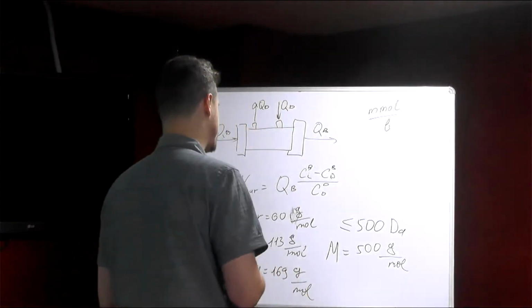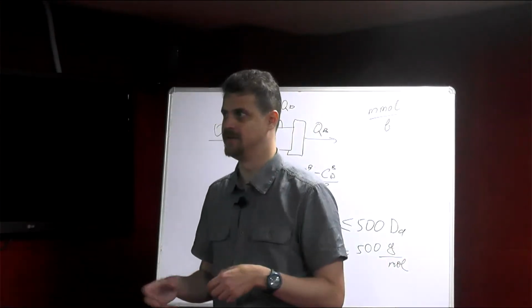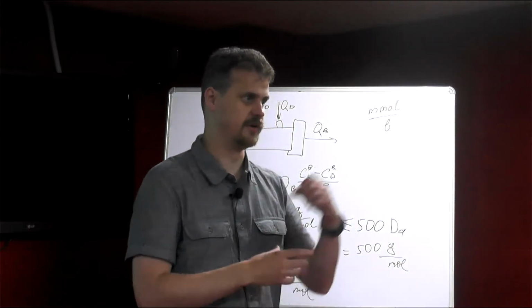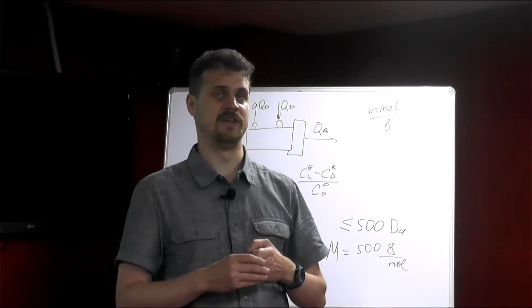And we need to control the nutrient concentration or the essential blood parameter concentrations. It could be the glucose concentration, or at some point it could be the iron concentration.